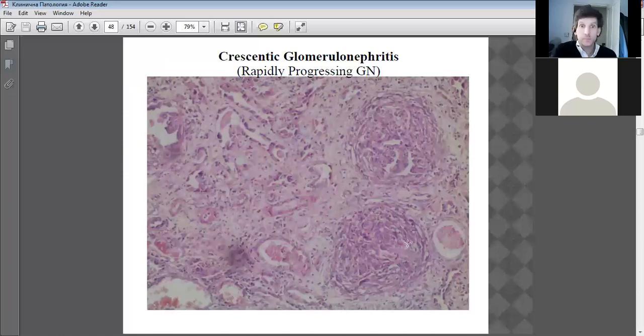Okay, here, rapidly progressing GN. Here you can see the total destruction of your glomeruli that collapsed. It's still got the round form, but the wall has collapsed. The Bowman's capsule has collapsed, and there's spaces forming where the knot of capillaries or ball of capillaries was. So they're also beginning to break down. So the membrane diffusion has been severely affected.